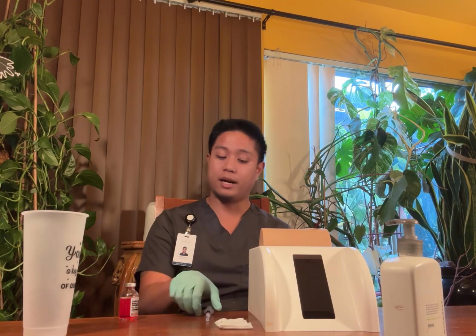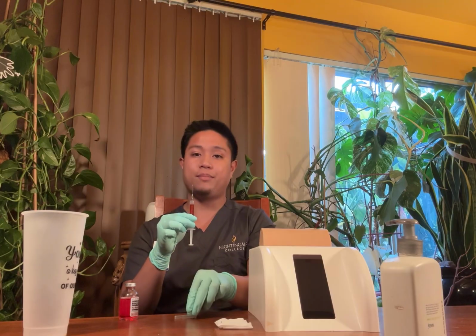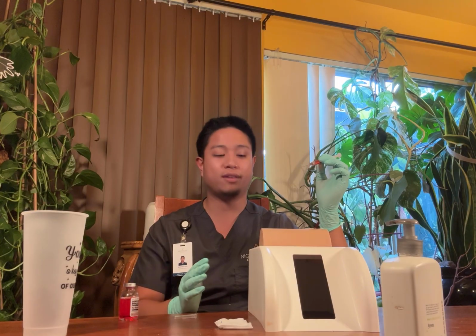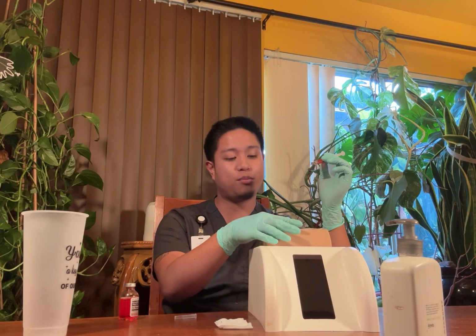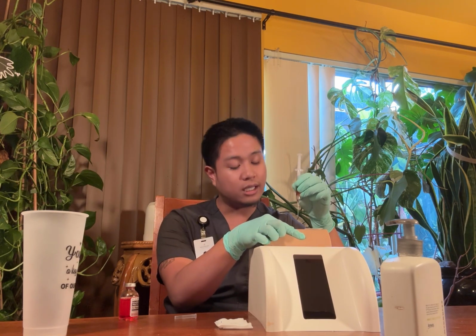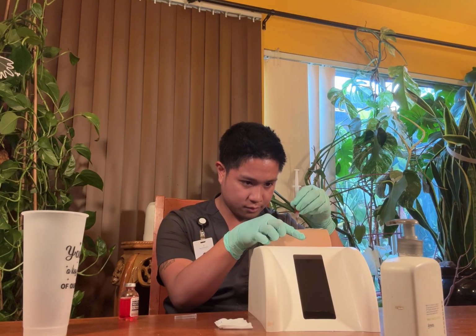I'm now going to uncap the needle, and I'll place the ulnar side of my hand up against the patient's skin and pull down so that it's taut, and I will pinch the side with my pointer finger and thumb. Now I'm going to inject the needle at about 90 degrees, going straight down.